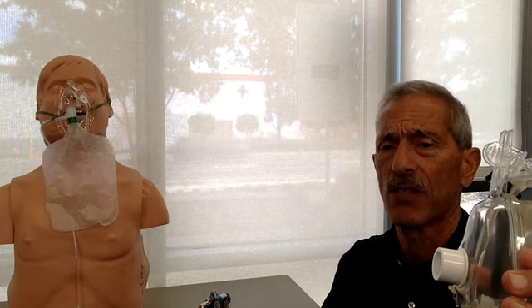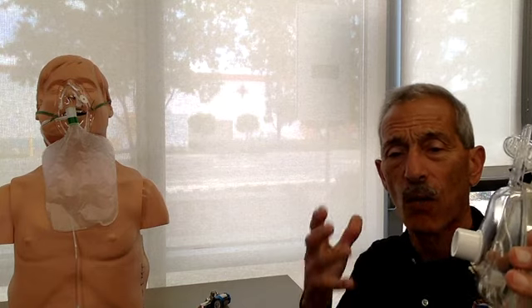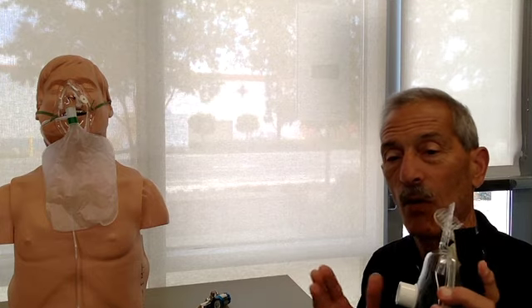It's a great device. The moral of the story is you've got to watch these people really carefully because they will stop breathing, they will go unconscious, and you might not notice it. But keep talking to them, keep interacting with them, ask how they're feeling, watch their saturations, see if they're going up or not, and just keep track of these people, because they start nodding off, and next thing you know, they die. So great device, but again, only for a narrow population of patients, and on top of that, there are some risks to these.